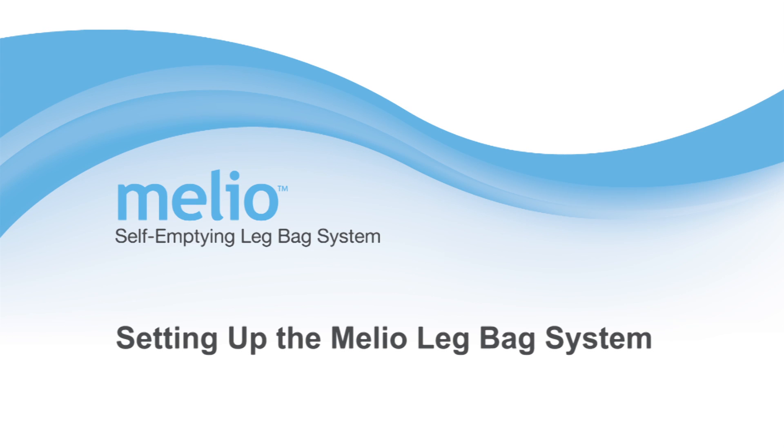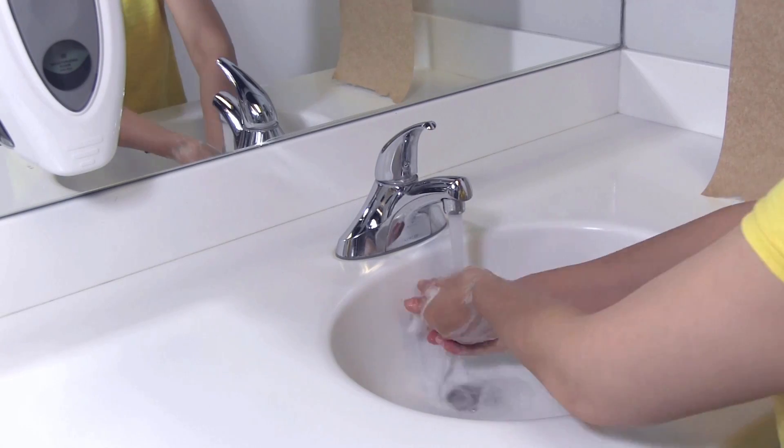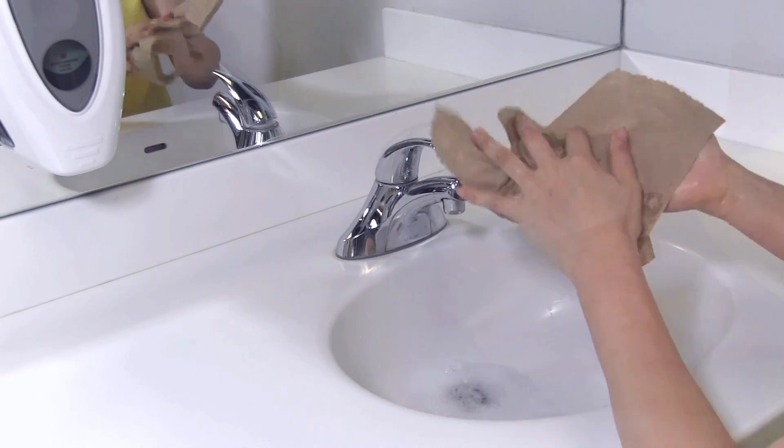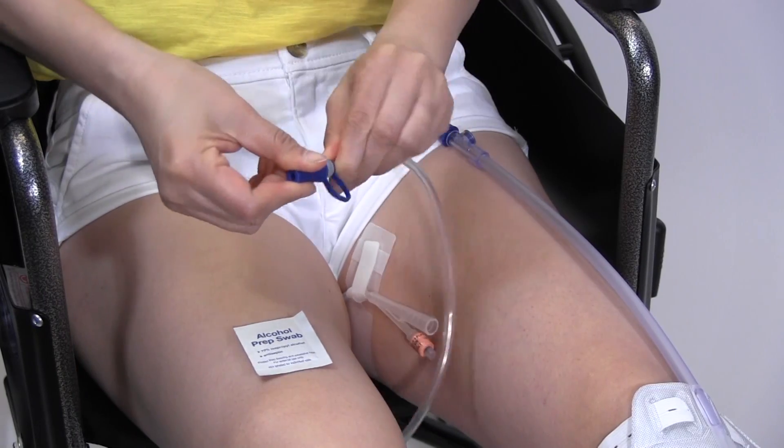Setting up the Melio leg bag system. Please wash your hands. Make sure that the end cap on the discharge tube is closed tightly.